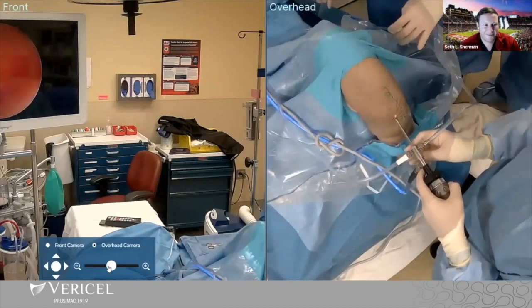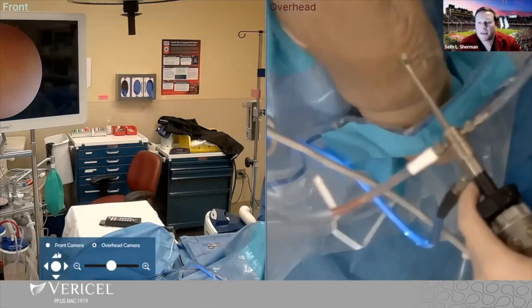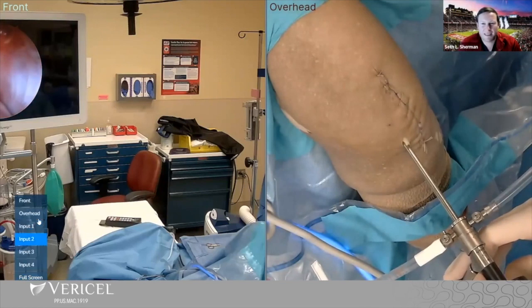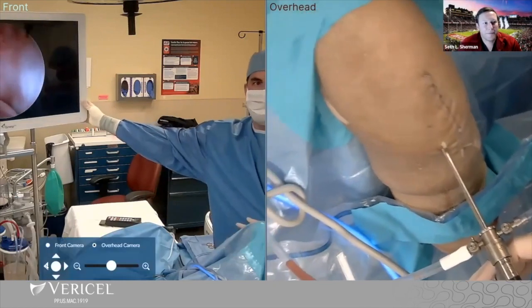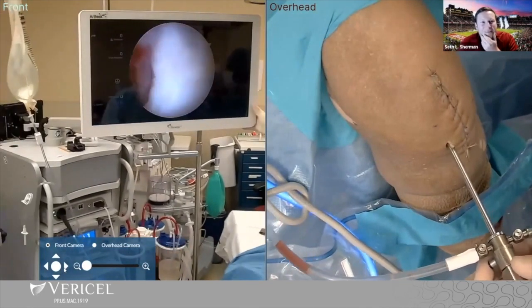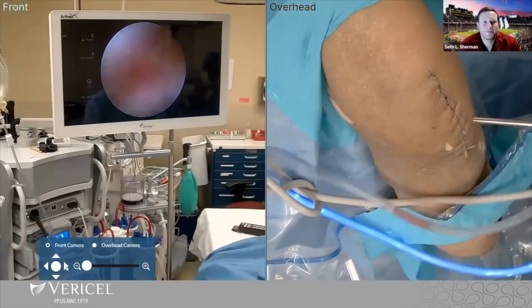Can you guys see this? I think the scope screen — we can center it a little better. Harvey, can we center the scope screen? Bring it towards yourself. Yep, that's good. That'll work.